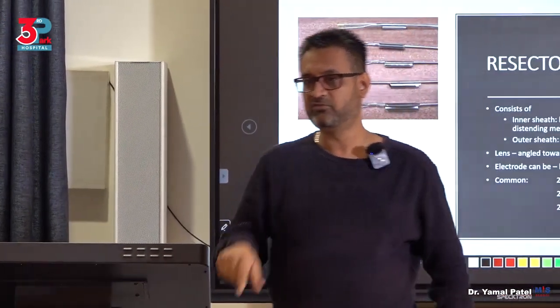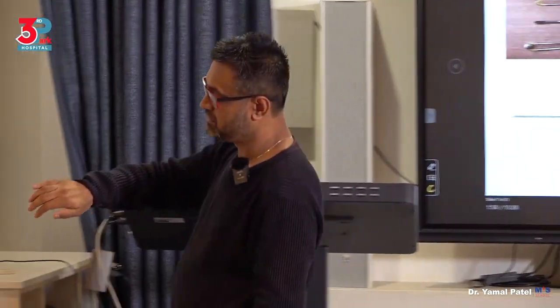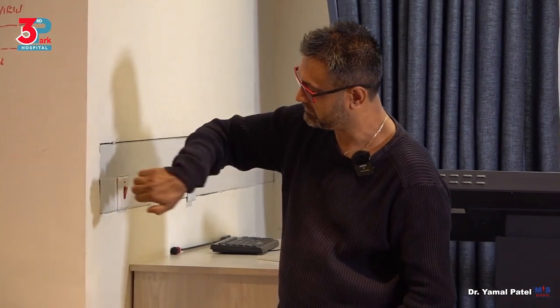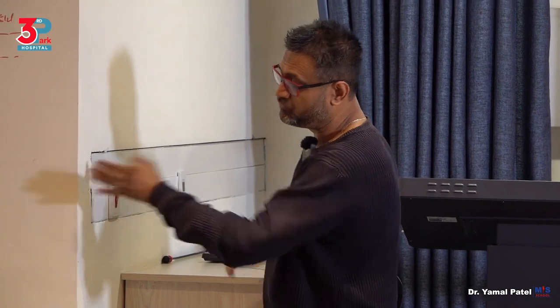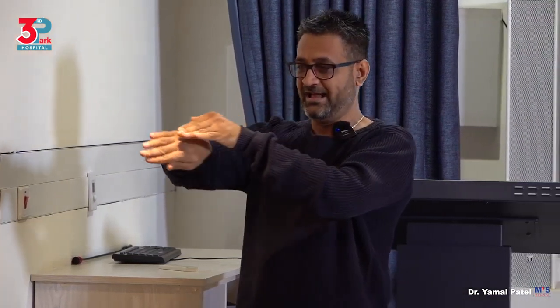The tip of the electrode cannot turn 30 degrees. It's rigid, it's straight. So if you're seeing very far off, when you're trying to, let's say, resect this part, you will need to be close to the view. Now, if I put it at 0 degrees, then I'm looking at it straight on. I won't be able to see the pathology and the tip of my instrument. So what I want to do is come up a little and see it from 12 degrees. You've understood? As I'm cutting.